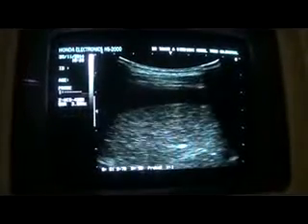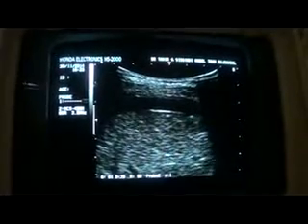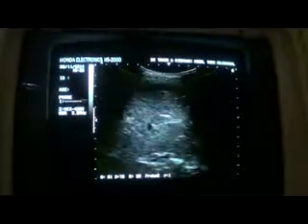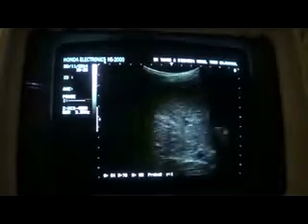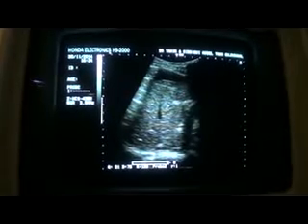So the information to be passed is that not every liver that appears bright is a cirrhotic liver. And the second point is that a liver surrounded by fluid will give you raised echogenicity as compared to the normal because of the speed of sound while it is traveling in this region where the fluid is surrounding the outer surface of the liver. So be careful while labeling such a liver as being cirrhotic.